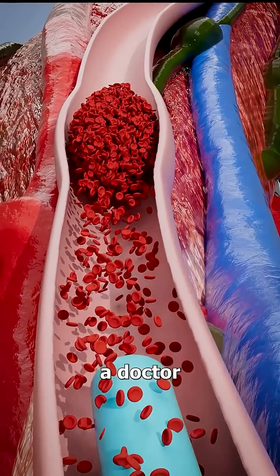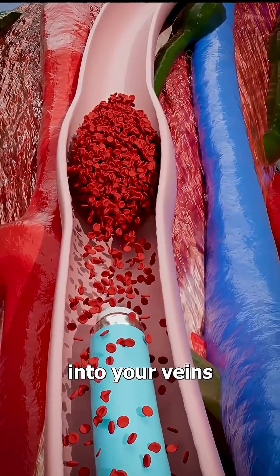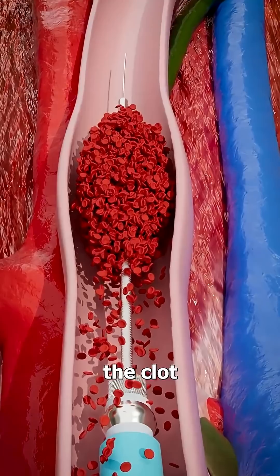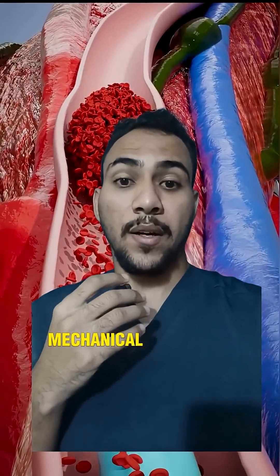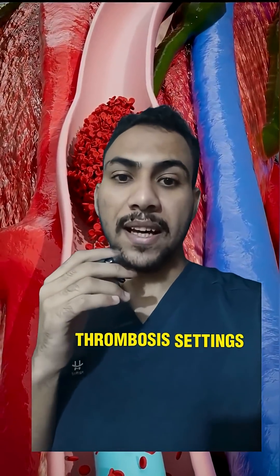If you have a blood clot, a doctor will sometimes insert a tiny vacuum cleaner into your veins. Once inside, a wire goes through the clot and a small mesh tube expands, capturing the clot. In medical practice, mechanical thrombectomy is used to remove clots, especially in stroke or deep vein thrombosis settings.